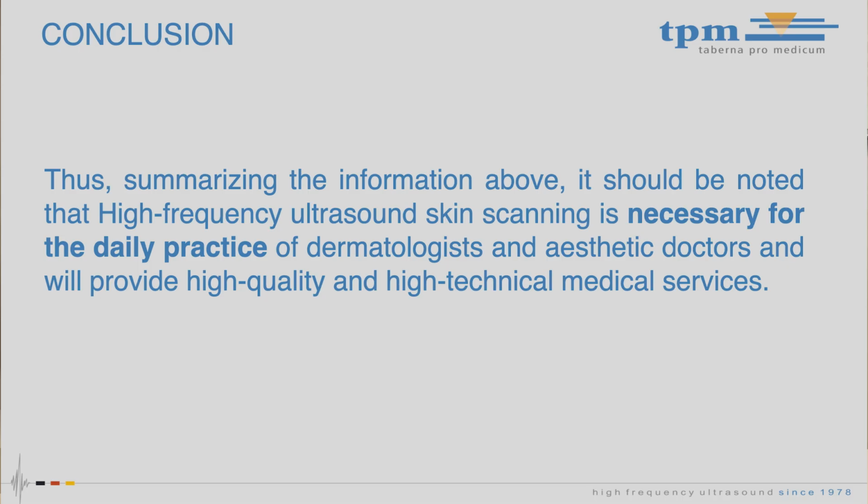When examining the skin in all layers, there is such a high resolution of up to 24 microns that minimal changes in individual layers can be assessed. The system has special software designed specifically for the skin. Thus, a very detailed examination of minimal changes inside the skin, even in the epidermis, is carried out separately in the papillary and reticular dermis and the hypodermis.